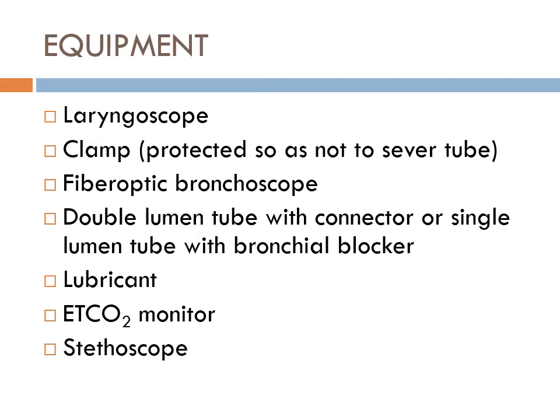So if I see a picture on the test, and I say, okay, we're going to ventilate and we want to do operations on the right side, which balloon would you inflate as a CRNA? Start off by saying, okay, where's right, where's left? If I show you an image of a fiber optic bronchoscope, you're going to have to know what you're looking at. If I'm operating on the right lung, which lung am I dropping? The right lung. You don't want air in the right lung. You don't want the lung opening and closing with ventilation, so you would inflate the right side, right?